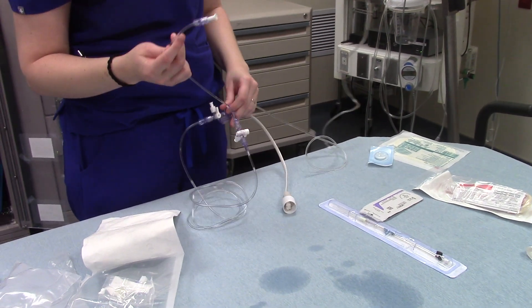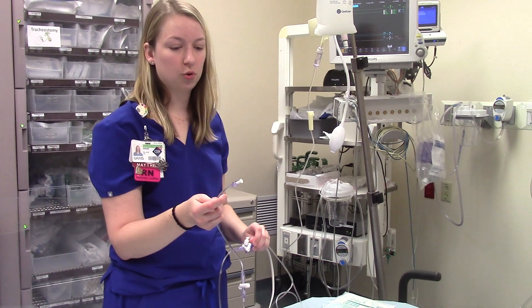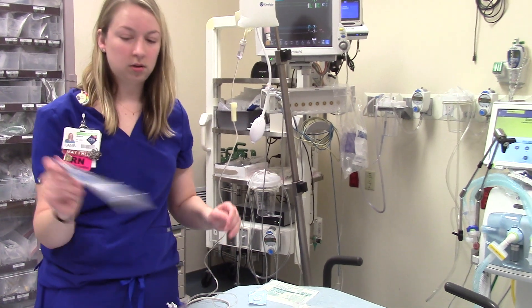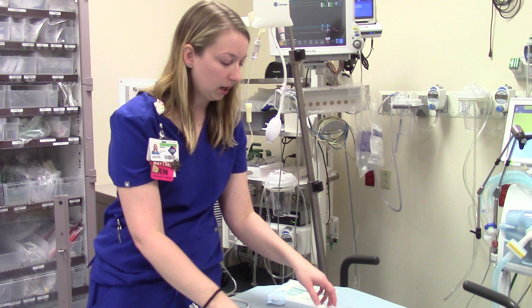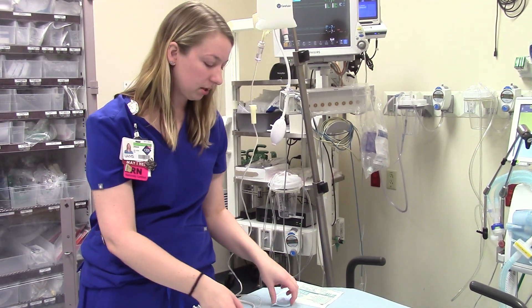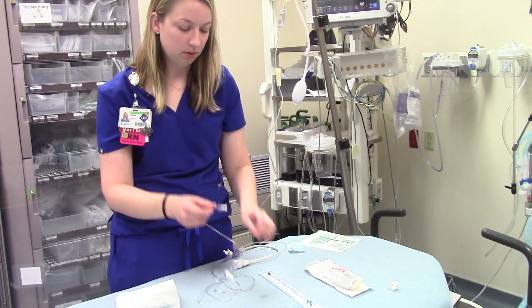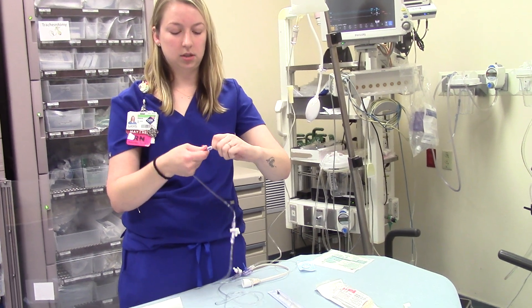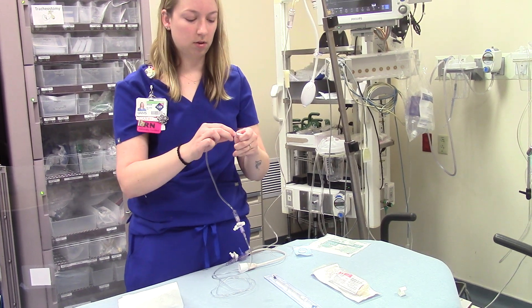Once I have everything set up and primed, right before we hook it up to the art line, I usually flush it one more time just to make sure we've got all the air out. The physician will have their catheter. You can facilitate by having a chlorhexidine prep ready for them to clean whichever area they're using. Once they get the catheter in and pull the needle out, you'll hand them the tubing — this needs to be sterile. Twist this off and make sure you keep the end clean and sterile while they're hooking it up to the art line.